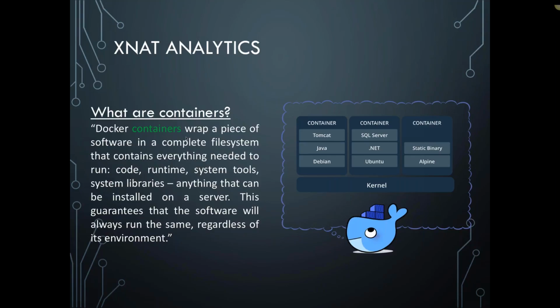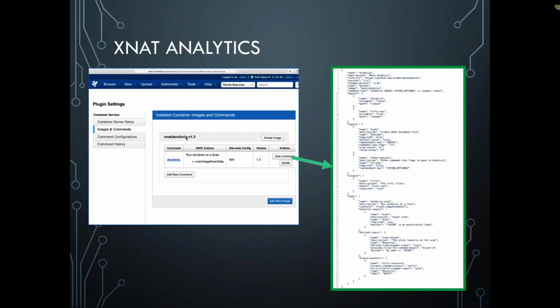And those can be all packaged up in one of these containers, and then you can share that container with people. They're very portable. We like the idea of using containers as ways to embed scientific routines that can then be dropped into a platform like XNAT and tied to data and workflows to automate many of the complex computational routines that are used in research. So this is what the XNAT interface looks like for working with containers.